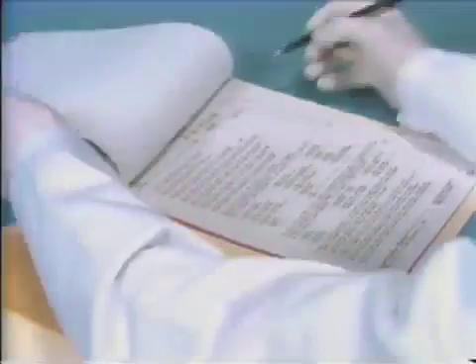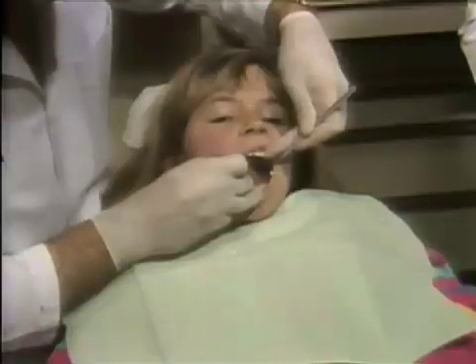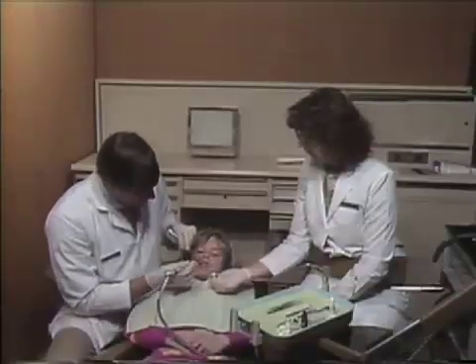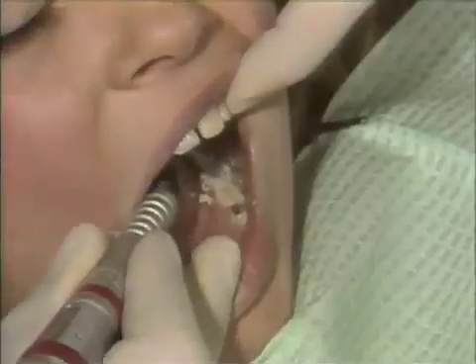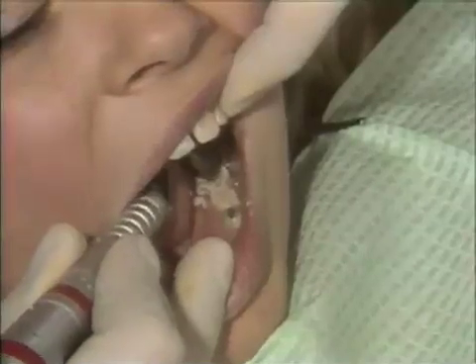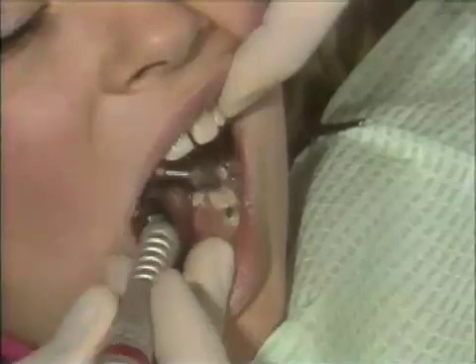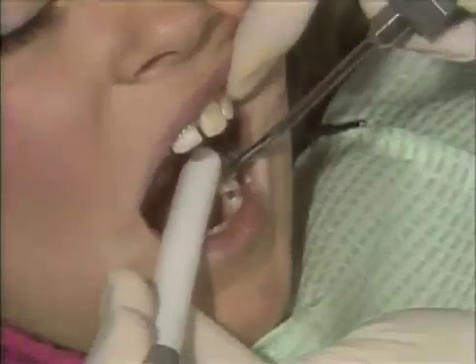Before commencing any treatment, a complete patient history should be taken. A thorough clinical examination, including radiographs, should then be performed, and the teeth to be sealed can be identified. The technique begins by cleaning the pits and fissures. A prophylaxis brush trimmed to a point can be used for this activity. Plain flour of pumice without any additives or fluoride is recommended, since these additives may interfere with the bonding procedure. The tooth surface should then be rinsed thoroughly with an air-water spray.